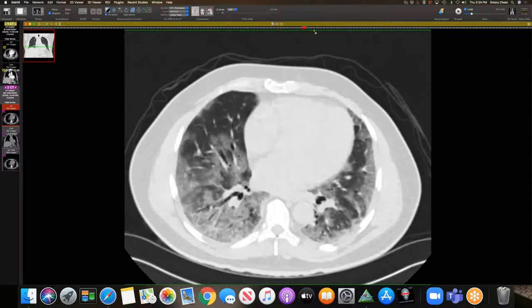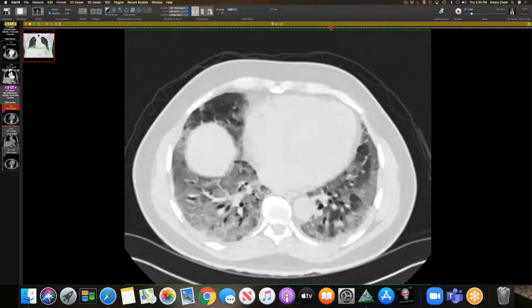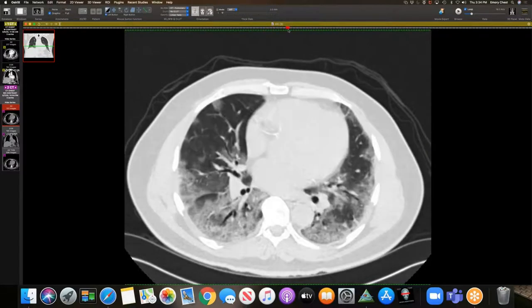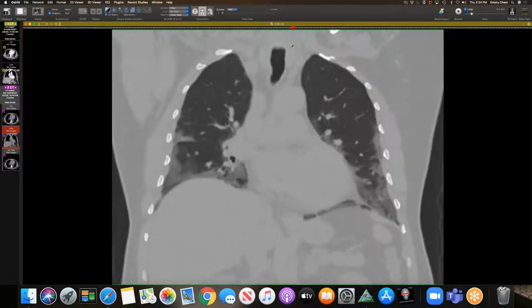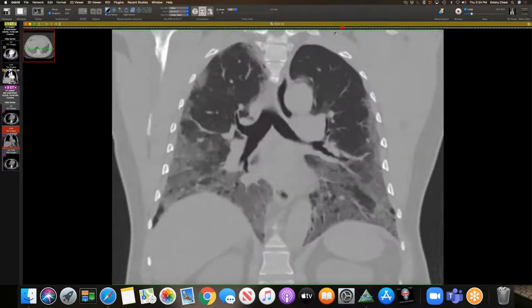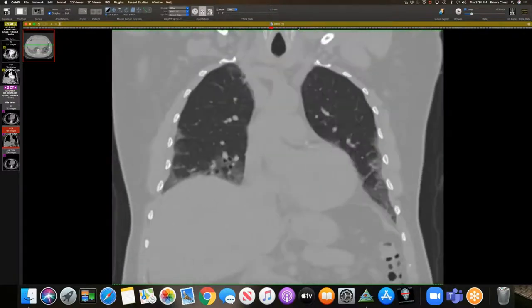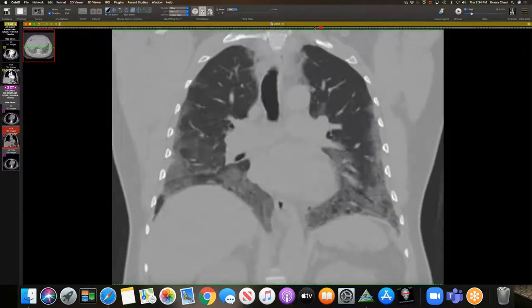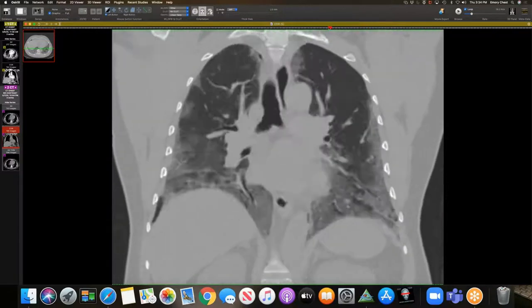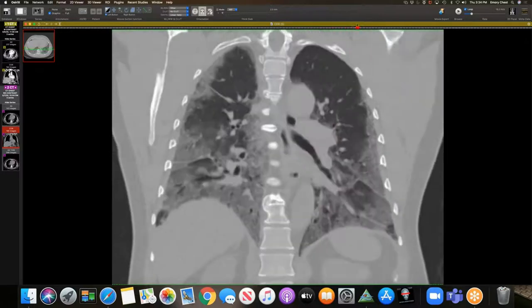So one disease entity that we see that may have a similar appearance is myositis, anti-synthetase syndrome, where right above the diaphragms you have some fibrosis and ground glass. On histopathology, those findings are usually a combination of organizing pneumonia and fibrotic NSIP. So you look at this, and in some ways this could look like that. This looks similar to that.